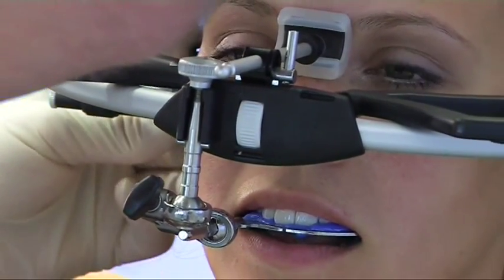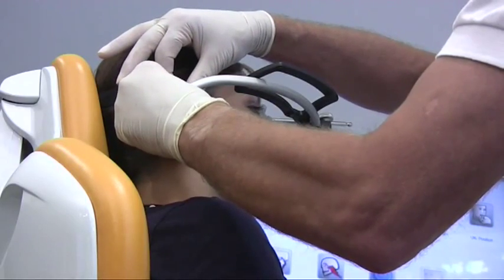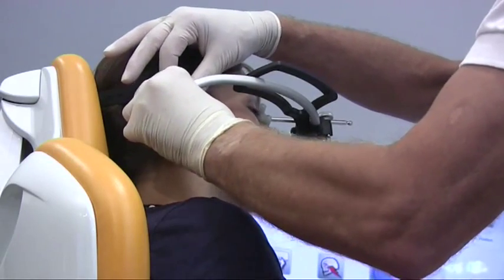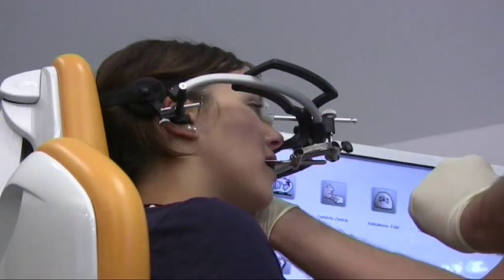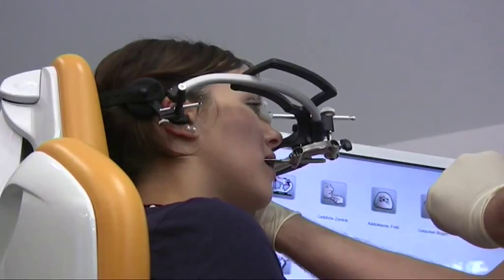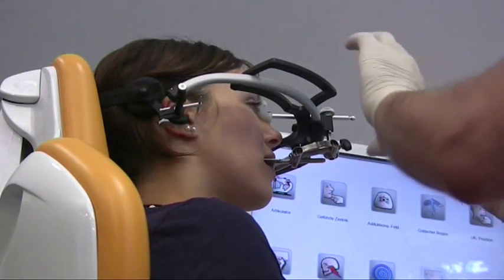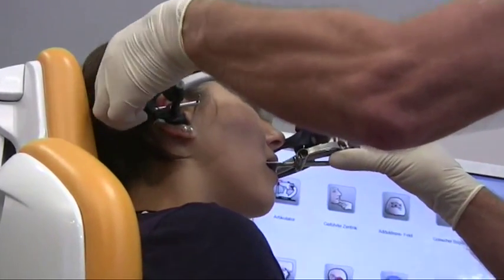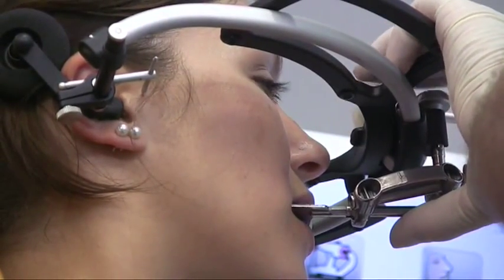Both axis pointers are now aligned to the marked individual axis point. The face bow can now be removed in the usual way.